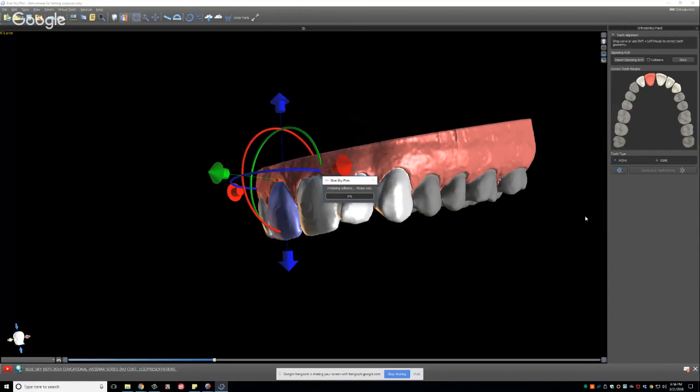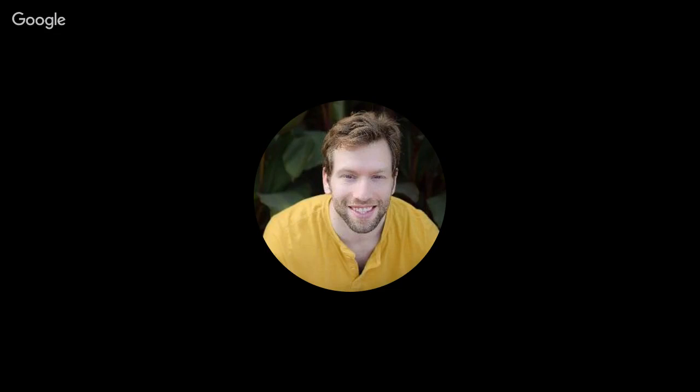Baron, a question came in now. What 3D printer do you use for the ortho IBT material?